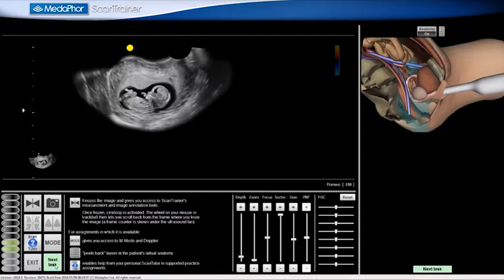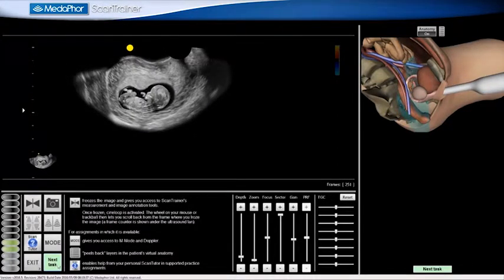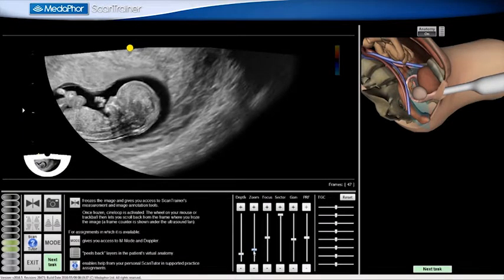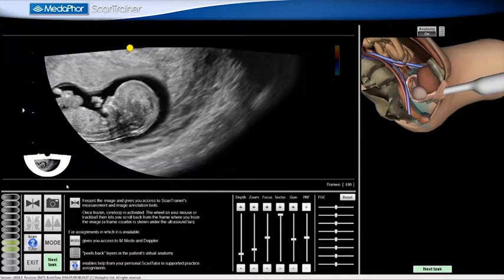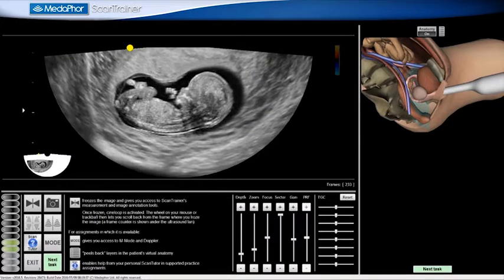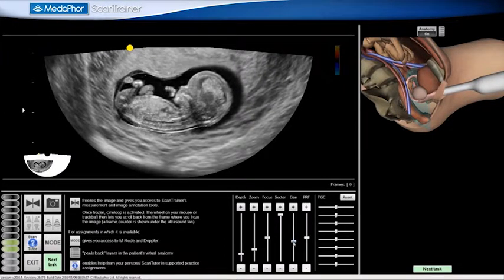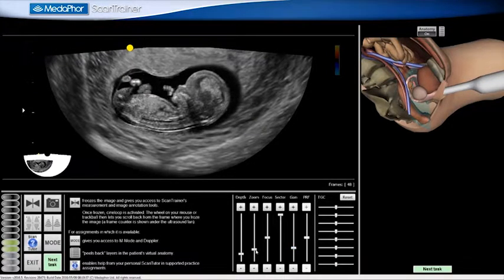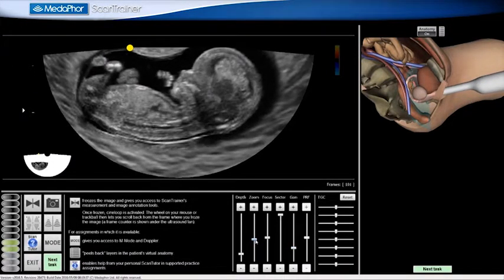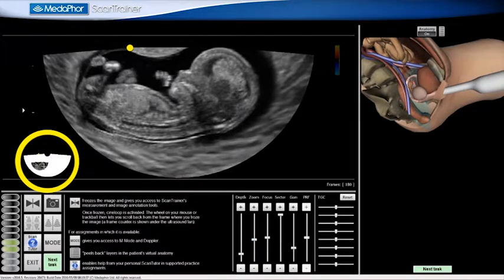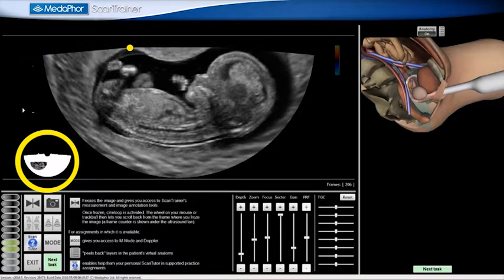I identify the correct plane for the CRL measurement. I demonstrate a midline sagittal section of the fetus, with the fetus appearing horizontal on the screen, and with the line from Crown to Rump at 90 degrees to the ultrasound beam. I optimize the gain and time gain compensation to achieve an even image throughout the depth, and if necessary, I adjust the depth of field, then the zoom, and pan the image so that the fetus fills more than 60% of the field of view.